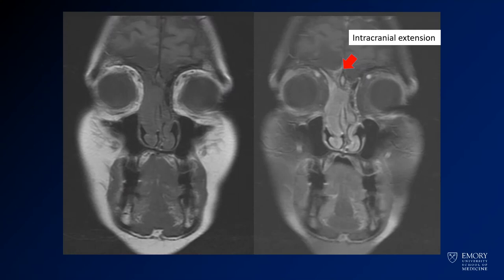Here you see the same thing on MR. You again have the cribriform plate, with mass involving the nasal passages on the right, and then intracranial extension. You also have a little bit of edema in the adjacent portions of the anterior frontal lobe, which is very common with these masses.